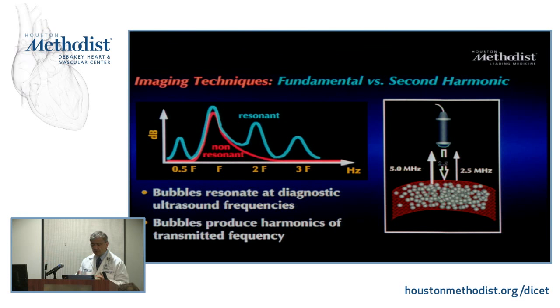And what do you use? Well, whenever you read, let's say, 4 megahertz H, okay? It means I'm listening at 4 megahertz, but my emission is at 2. If I'm listening at 3, my emission is 1.5. And we have some sonographers who like to use this lower end, and we should not.